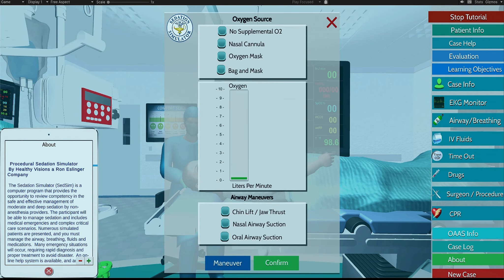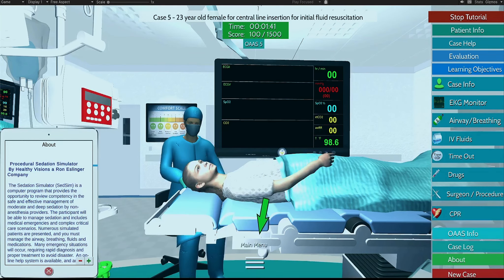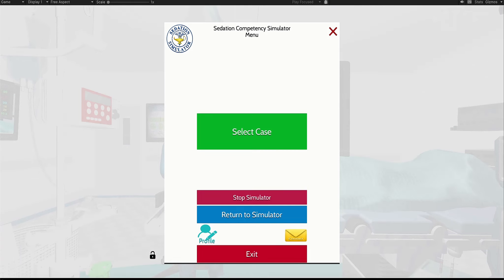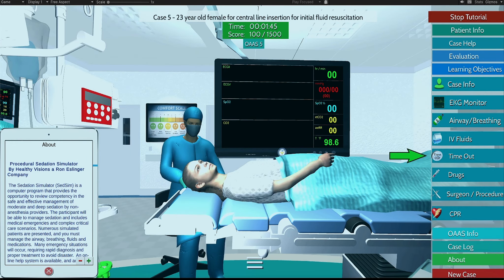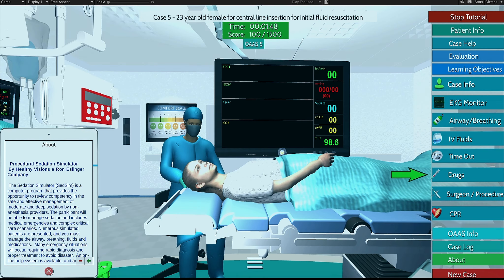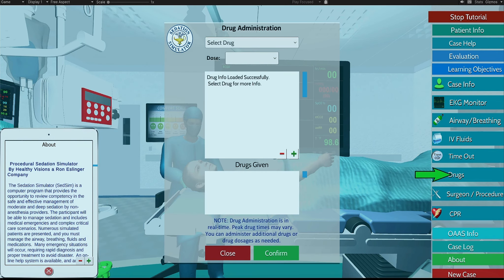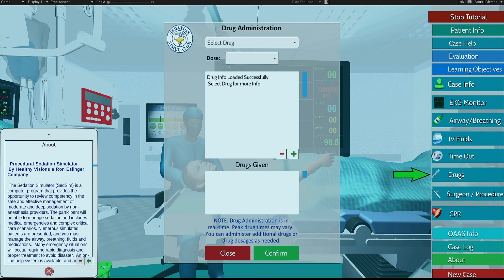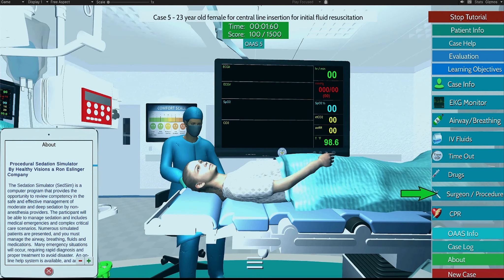This icon is your main sedation simulator menu. This icon is your time-out assessment. This icon is your drug administration order form. All drugs administered are in real-time and based on the patient's history, weight, drug type, and dosage.